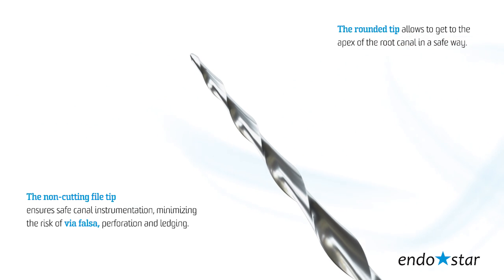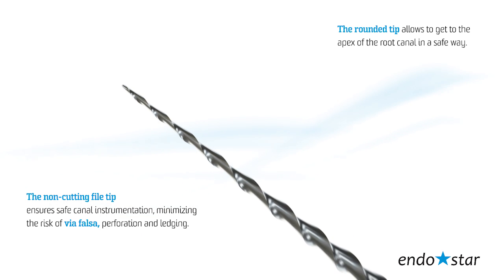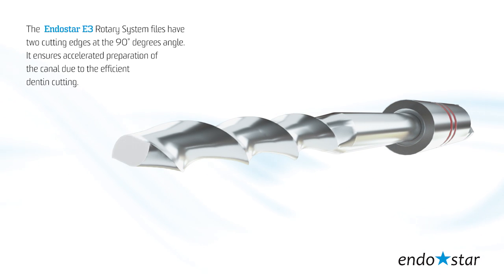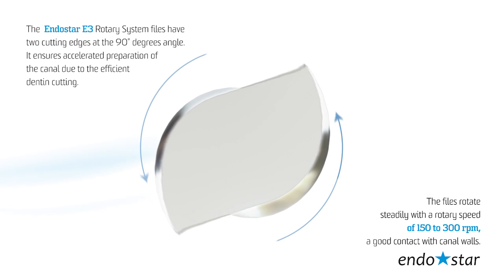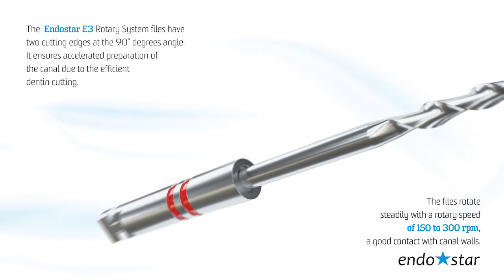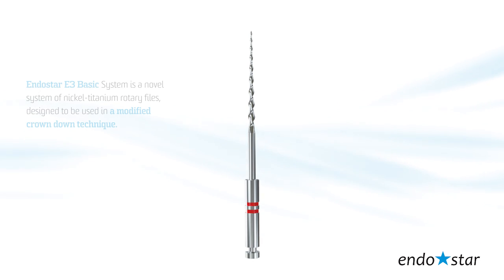The rounded tip allows to get to the apex of the root canal in a safe way. The EndoStar E3 Rotary System files have two cutting edges at a 90 degrees angle, ensuring accelerated preparation of the canal due to efficient dentine cutting. The files rotate steadily with a rotary speed of 150 to 300 rpm, keeping good contact with the canal walls.